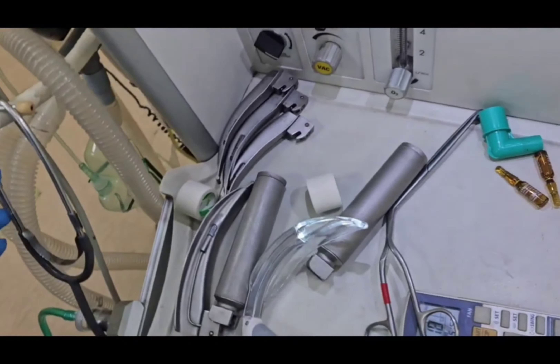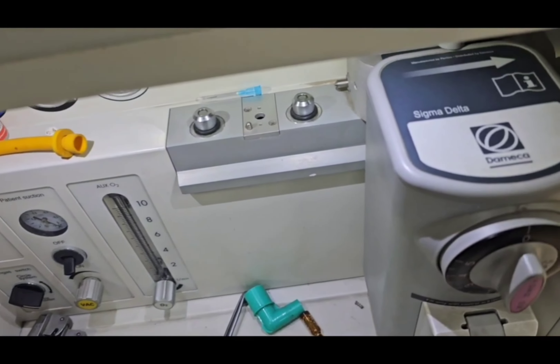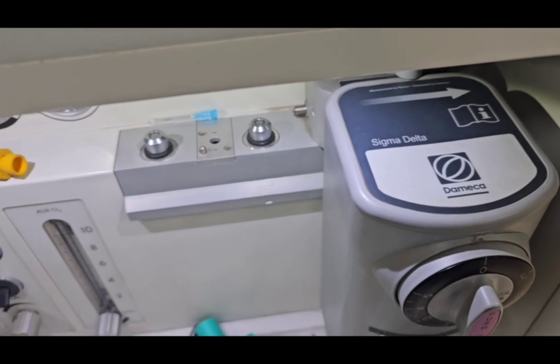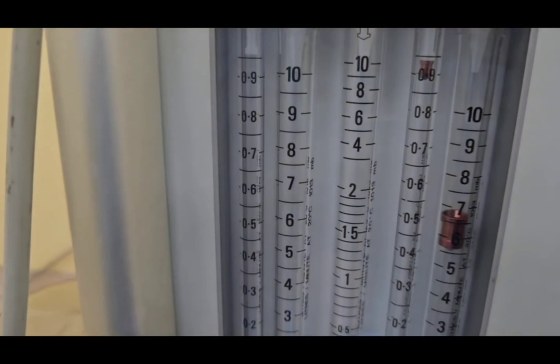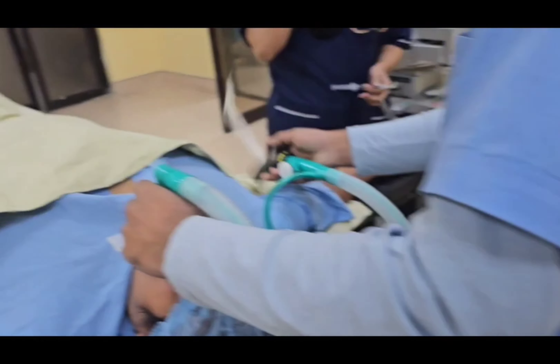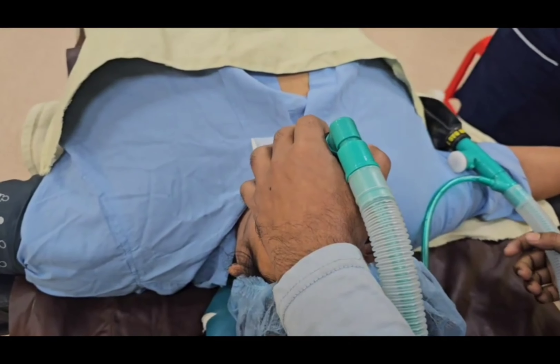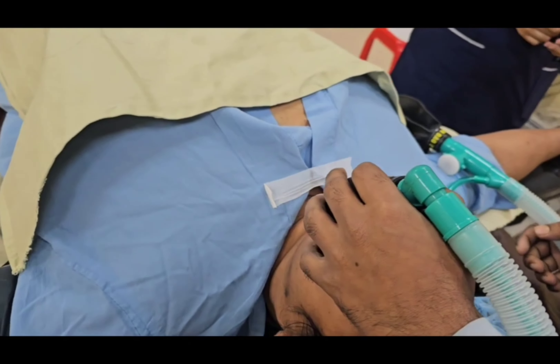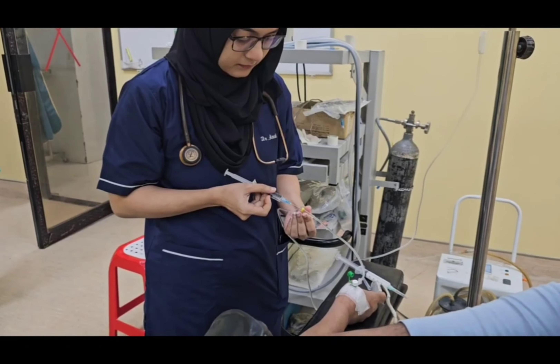Here are some drugs that we are going to use for general anesthesia. Now we are fixing the 100% oxygen and other gases. We are starting the general anesthesia — at first we are doing pre-oxygenation for 5 minutes with 100% oxygen.